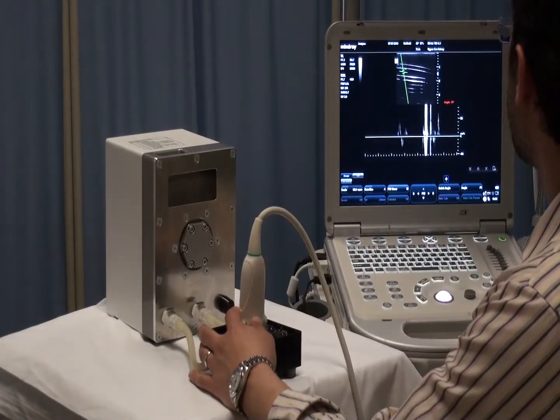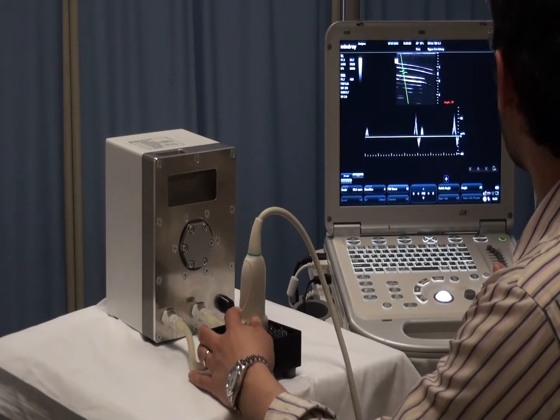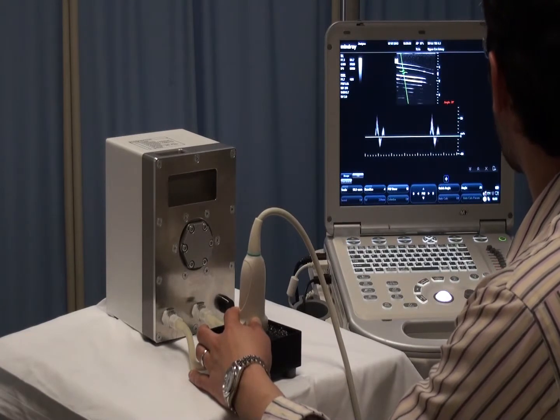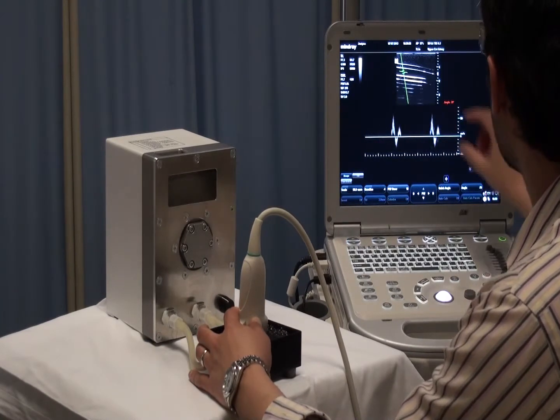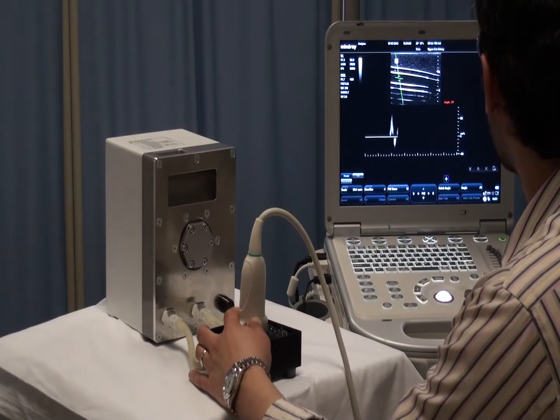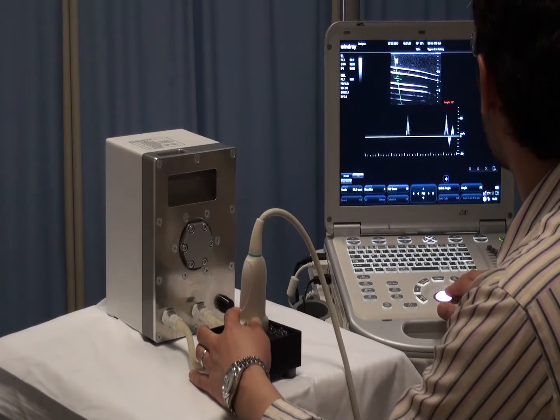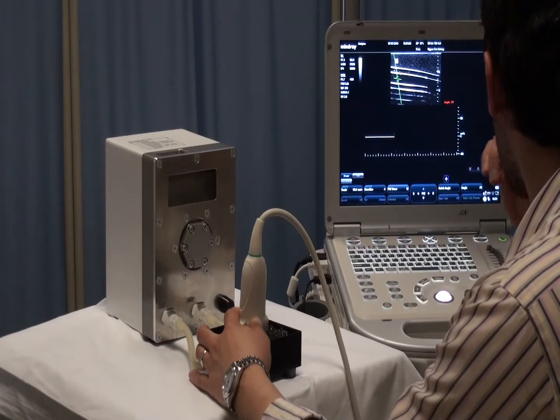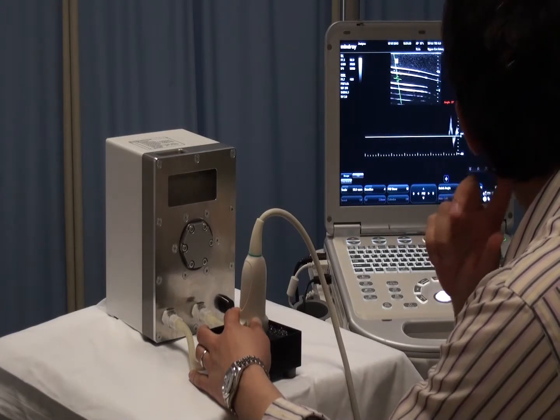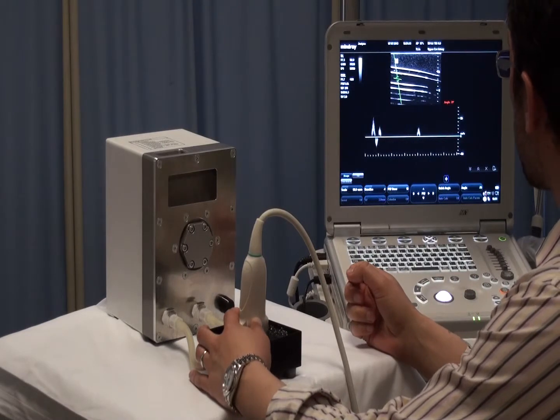Okay, so here we can see the B mode image at the top of the screen. You can even see the speckle pattern of the blood mimicking fluid. You can see some reflection artifact in the lower part of the B mode image. We can omit that by changing the depth setting. You can see a very nice triphasic waveform here, representing a common femoral waveform.